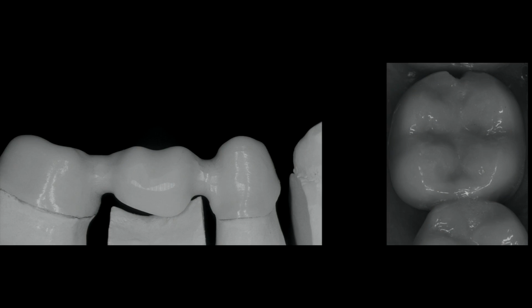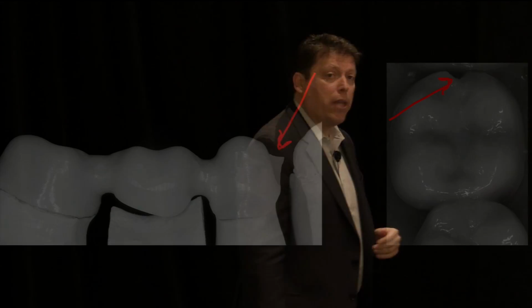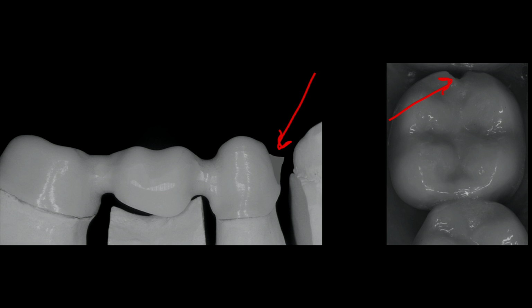So if you look at this framework, and I'm sure that you have seen frameworks such as that in your offices, we would love to have some more ceramic coping materials, in this case zirconia, to support the veneering layered porcelain at the marginal ridge area, to avoid situations such as what I experienced here on that second molar, a fracture of the porcelain at the marginal ridge.